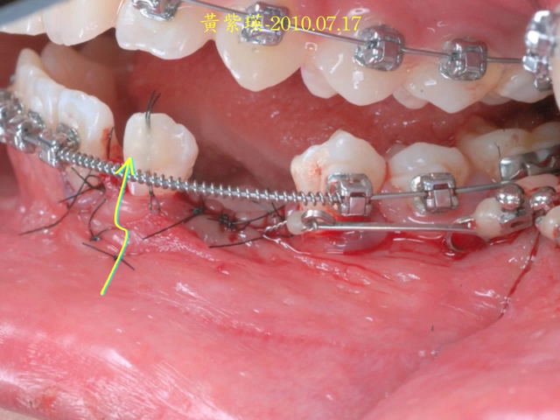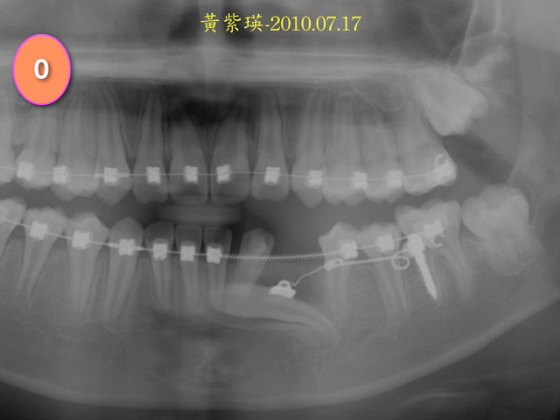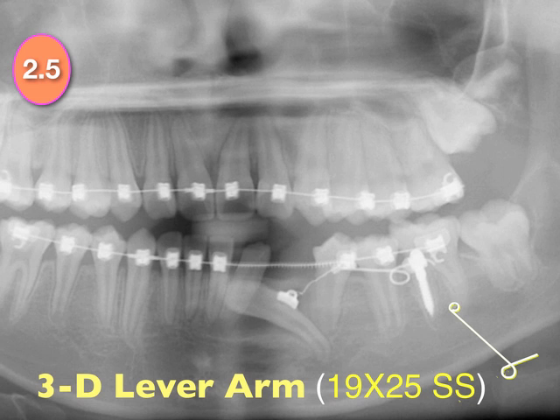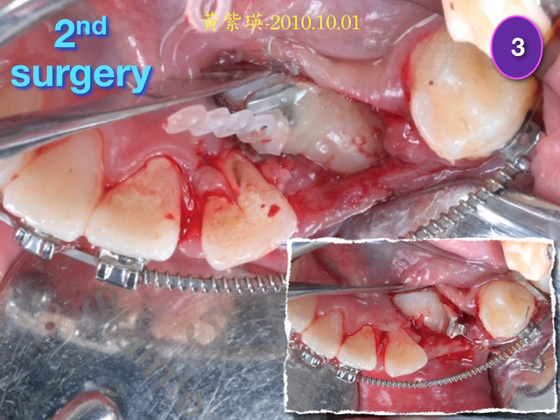And I also put the screw in the buccal shelf. And I also did this coronal reposition flap, trying to avoid gingival recession. When you look at it, I bonded right in the middle of the root. No problem. That's close to the center of resistance. My professor liked it. So I bonded on the root, and in 2.5 months I was able to upright it with this 3D lever arm on 19x25 stainless steel, and I did a second surgery.